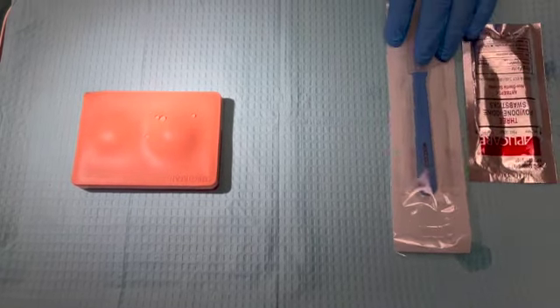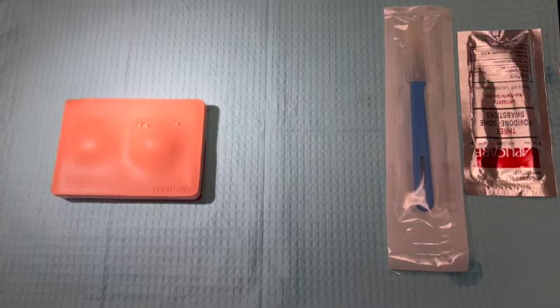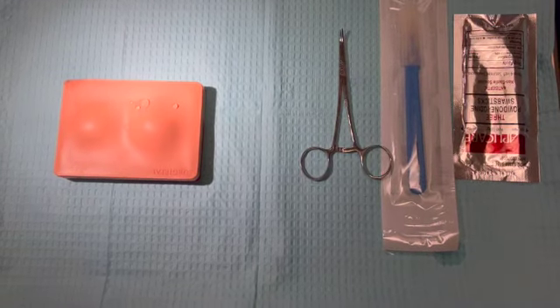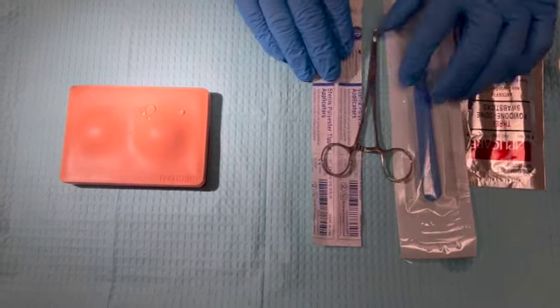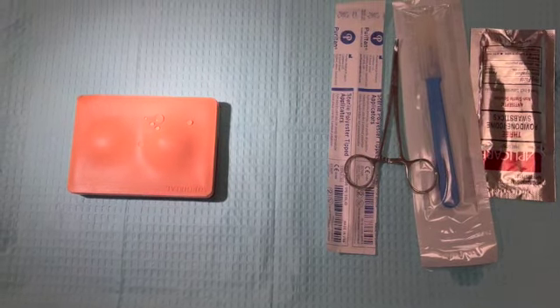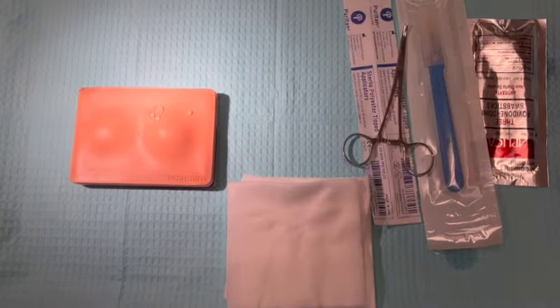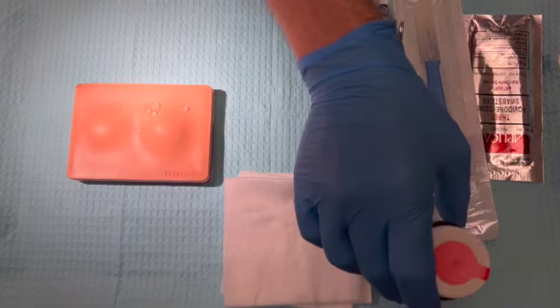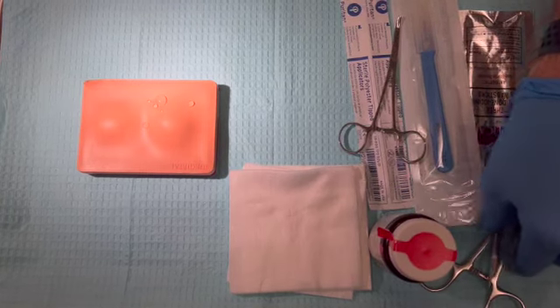I'll start with my betadine solution that I'll clean the area with, my scalpel to make the incision. I'll put out curved hemostats that I'm going to utilize in order to help break up loculations. In this setting, we're going to use this as our culture swab in order to get a culture, if that's indicated. We'll go over those indications in a bit. And then ultimately, of course, we want to have ample gauze available as well, anticipating potential release of purulent tissue. And then finally, I'm going to set out packing with my scissors, as well as just some forceps to pull the packing out with, which we'll cover in a bit.